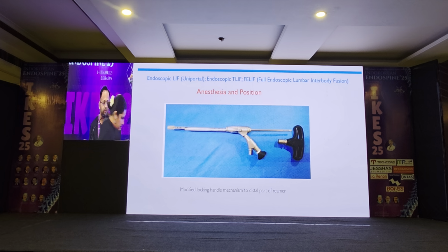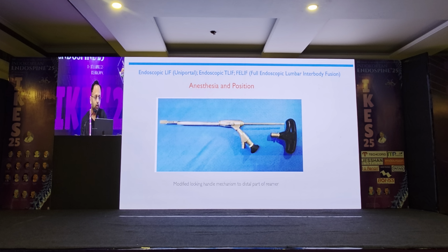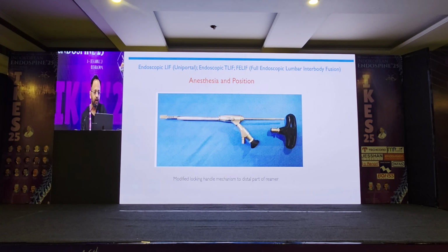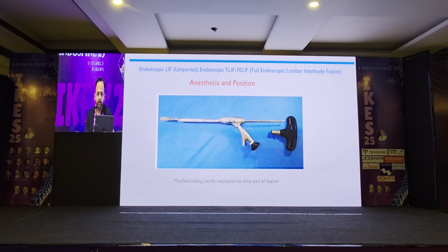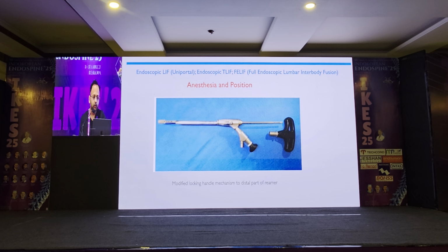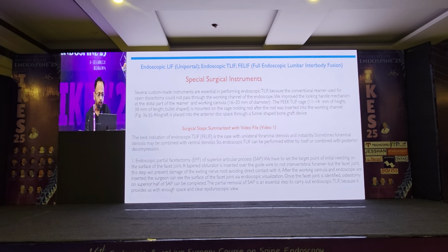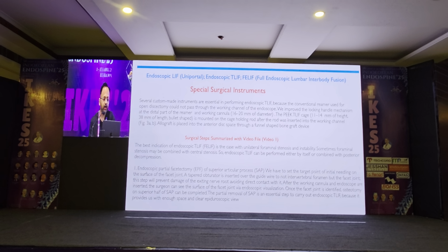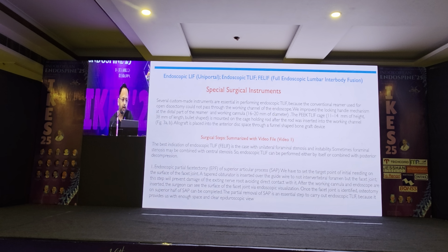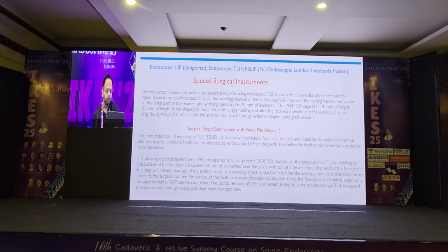These are the specialized instruments where the instruments go in a reverse docking fashion. So even the bigger paddles, bigger disc rasps, bigger instruments, bigger dummy cages, all of it is tucked in from outside the scope and can be used. I think these things have been seen recently by Kaushal and others. Of course, when you are trying to do new minimally invasive techniques, like laparoscopic surgery, you need a good armamentarium. The armamentarium is the key for developing new techniques.